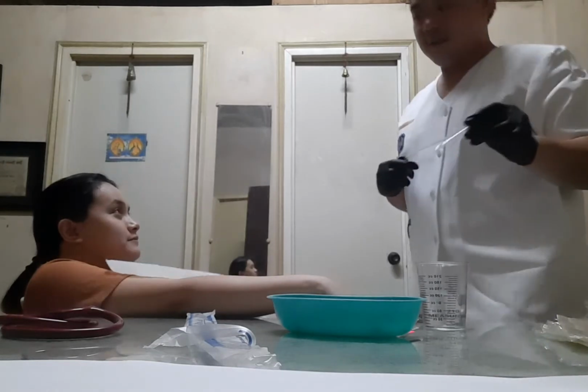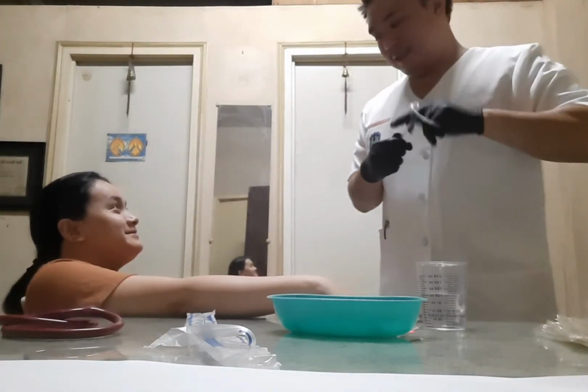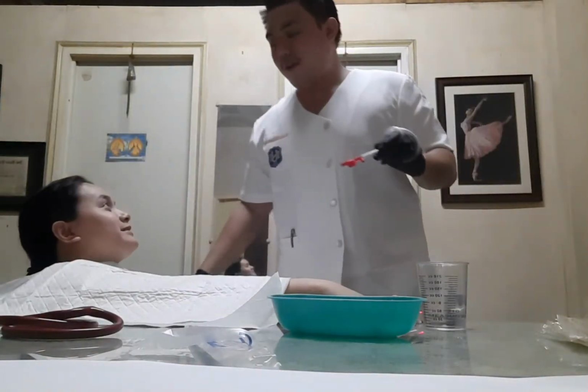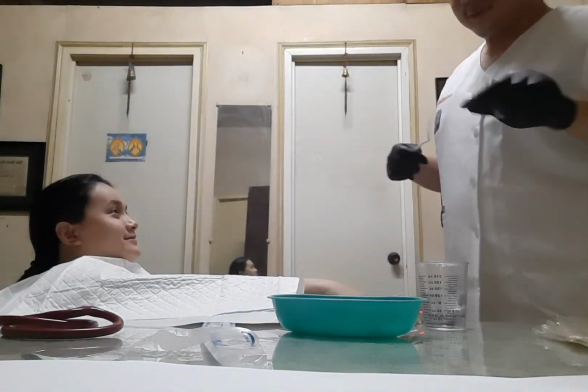Then again, apply the oops. Sorry po. Wala po kasing bedside. Wala kasi kami kamo, hospital.